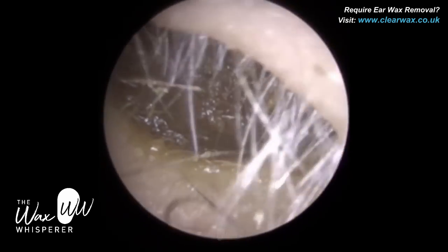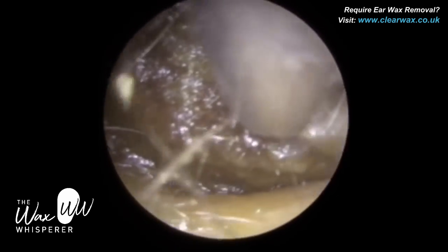A patient attended with bilateral impacted earwax. We're just starting off in the left ear.